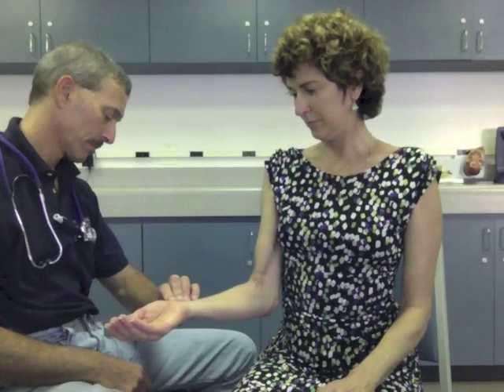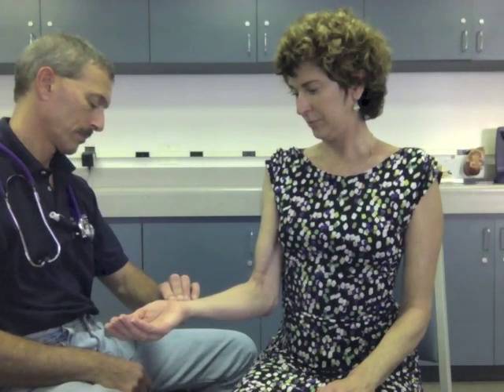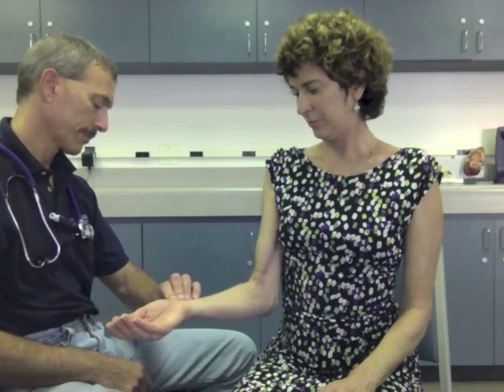First I'm going to start out by getting the patient's pulse. Because this is an awake and alert patient, I'm going to obtain the pulse at the radial site. I'm going to take two or three fingers, locate the radial pulse, count for 30 seconds, multiply times two, and I'm going to get rate, rhythm, and quality. Patient has a strong regular radial pulse.